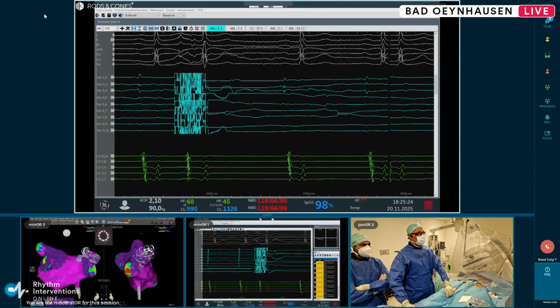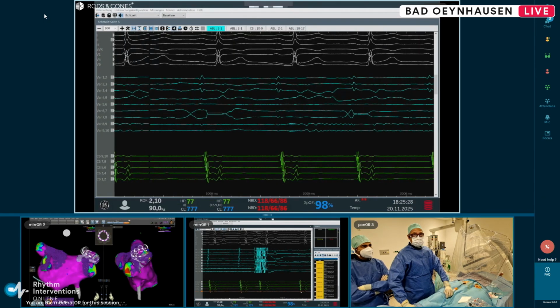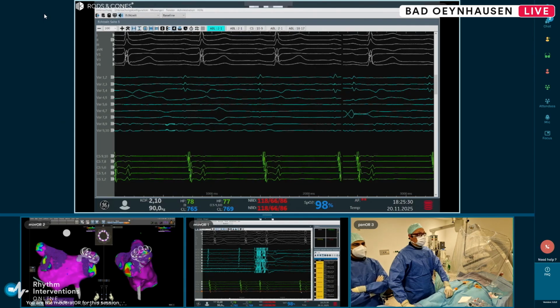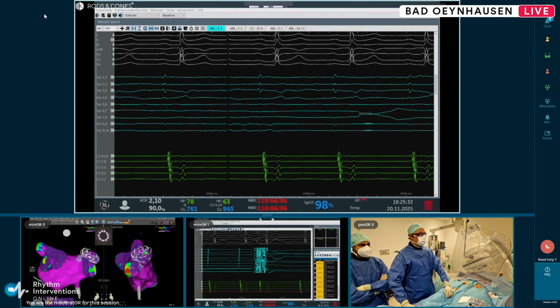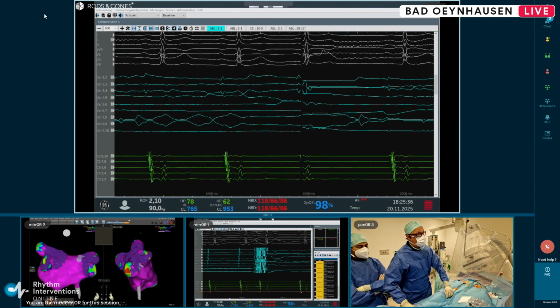Second application so far, which means we only have 2 applications left. But I think we're more or less good in time. And it shows us really that we can do these live cases within.